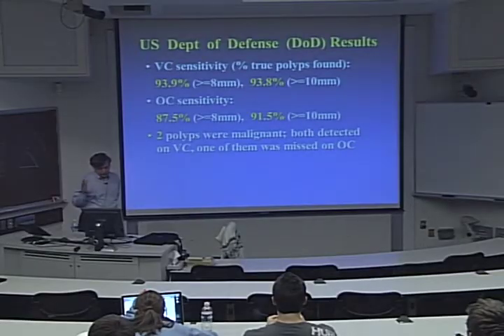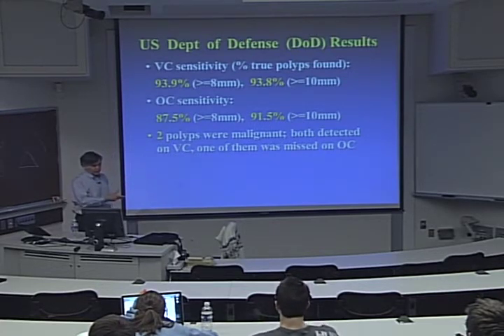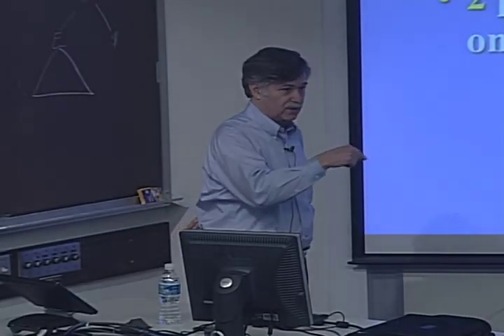So I'm not sure what they did with the optical, but I know with the virtual colonoscopy, they compared it to optical and the pathology. If they had a polyp that they found in the optical and went to pathology and it indeed was a polyp and was not found in the virtual, that was classified as a miss.